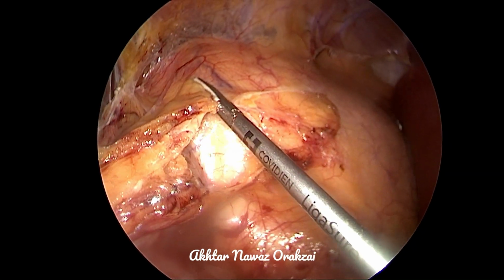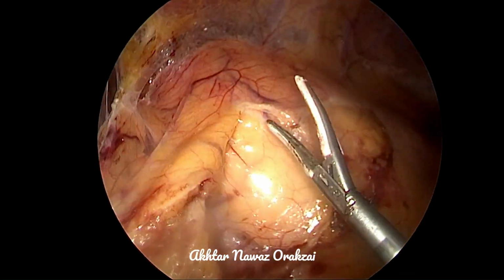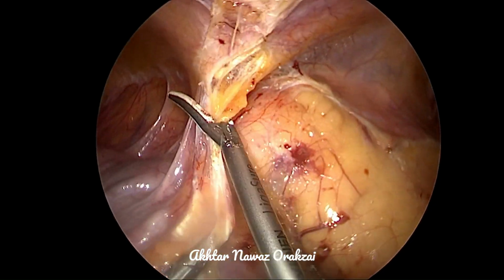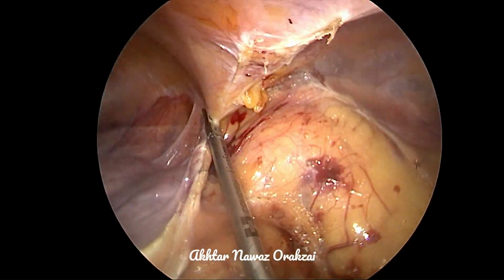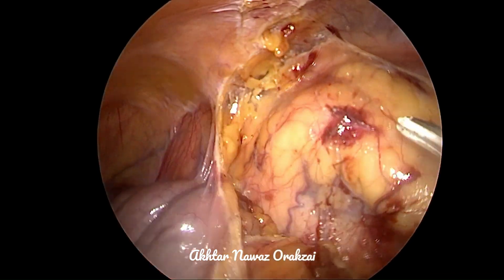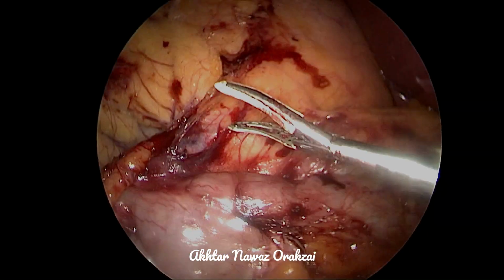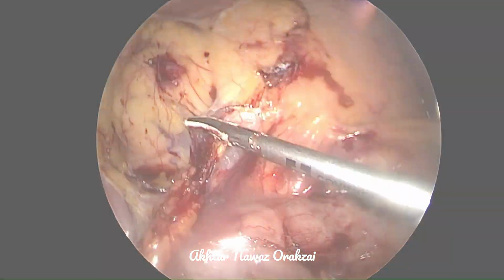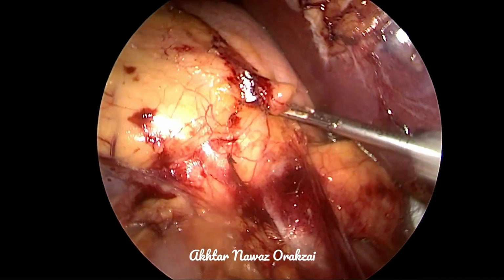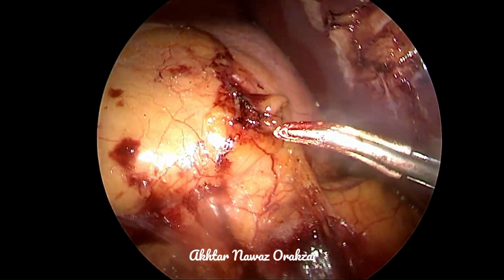And now we mobilize the hepatic flexure and the ascending colon medially, as these are the routine steps of simple nephrectomy, radical nephrectomy, and partial nephrectomy. Here one can see the wall of the duodenum clearly.